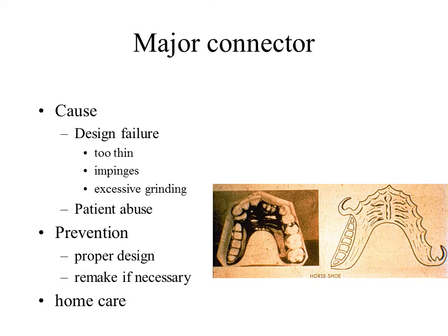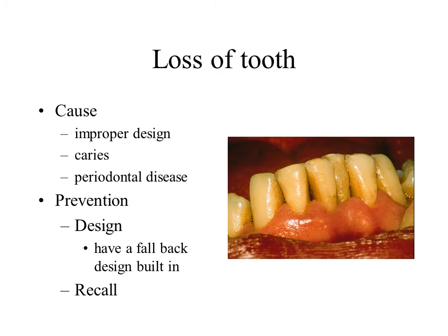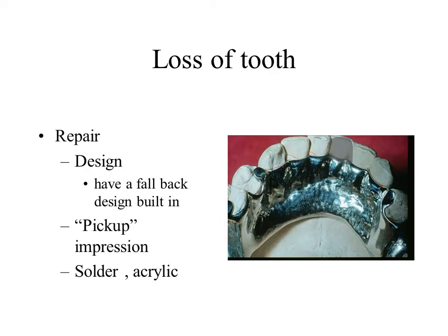Loss of tooth not involved in support or retention. These can be replaced with artificial substitutes, depending on the design of the partial denture. Loss of artificial teeth. These may be reattached or replaced.